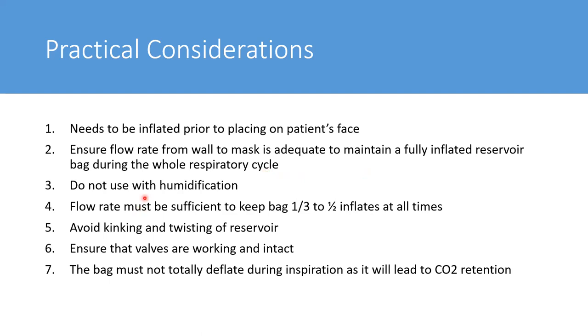There is no need for humidification in this device. It must be sufficient flow to keep the bag 1/3 to 1/2 inflated at all times. Make sure that you avoid kinking, because if you kink it, you remember that the patient is only breathing from here, and therefore, if it is kinked, the patient will be breathing zero oxygen.